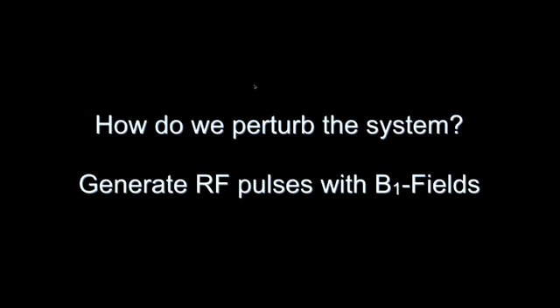Then the question is, how do you perturb the system? How do you go from that equilibrium state of water protons inside a B0 field to generating some transverse magnetization? We perturb the system by generating RF pulses, with the so-called B1 field.